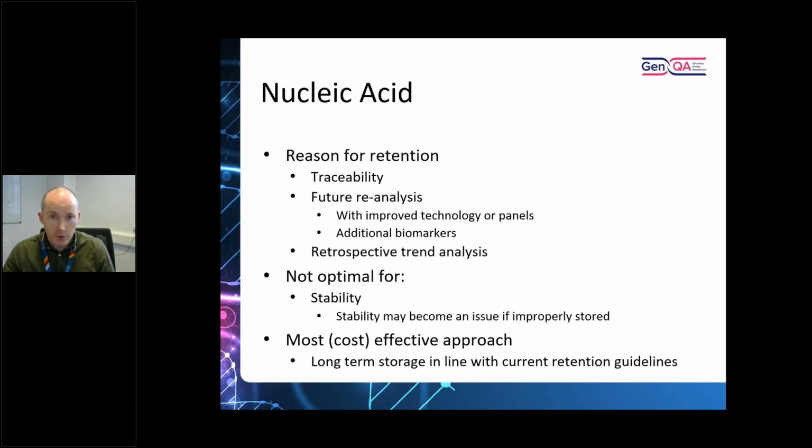It's not optimal for stability, it can go off over time. So if a 20-year-old sample is used, it may not be optimal compared to using one that's just been extracted today. And it is a very cost-effective long-term solution for storing data, because you can reanalyze it in the future. You can analyze it for something else. You can use a different panel. There's lots of different advantages to it. So nucleic acid is pretty much a no-brainer. And then in between that, we have lots of other things that we could look at.